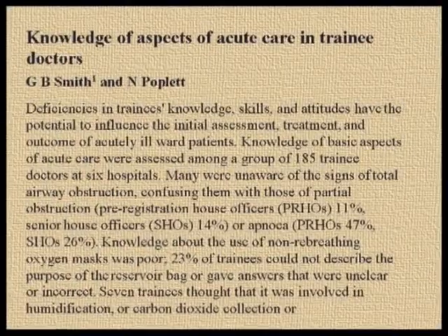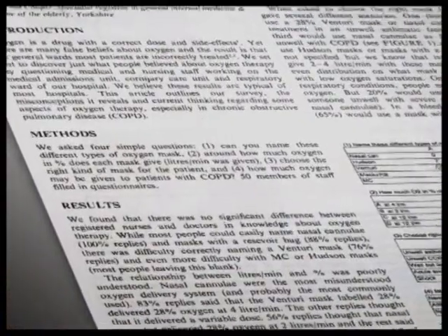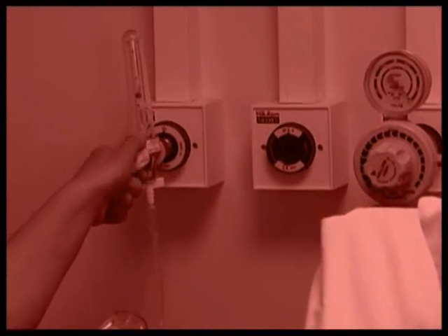Recent papers have shown that amongst practicing trainee doctors and nurses, there is a lack of knowledge of oxygen therapy devices and their correct use. There are also many false beliefs regarding oxygen therapy, with the result that many patients on general wards are incorrectly treated.